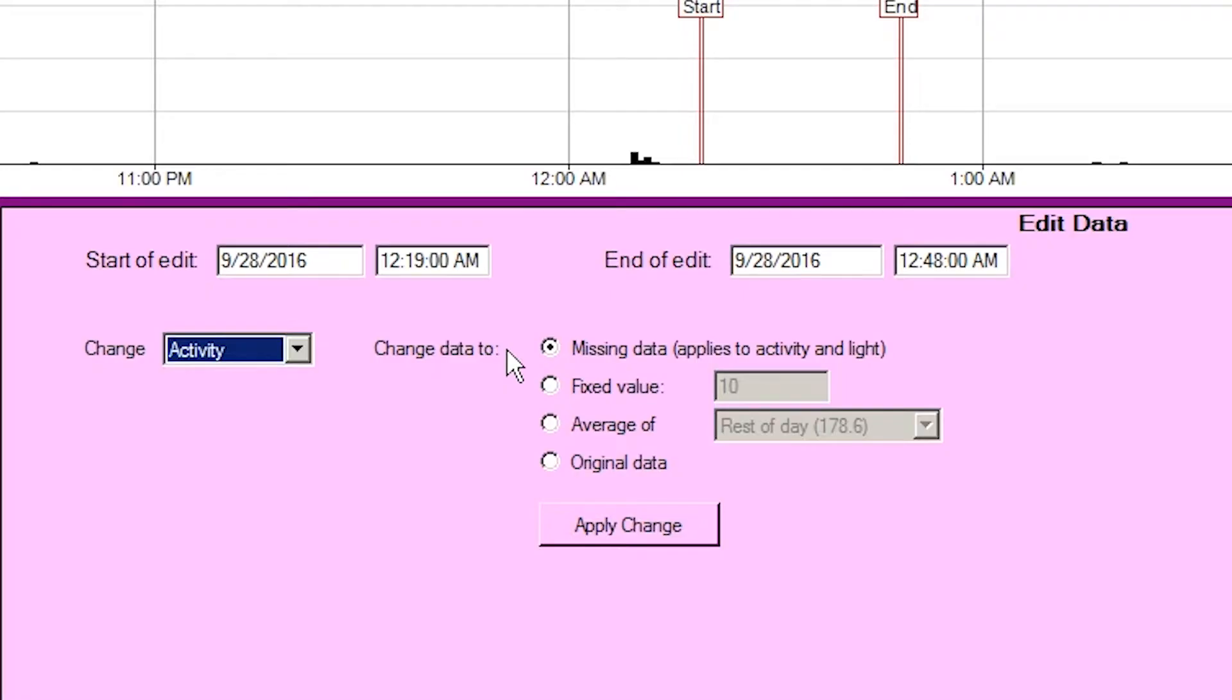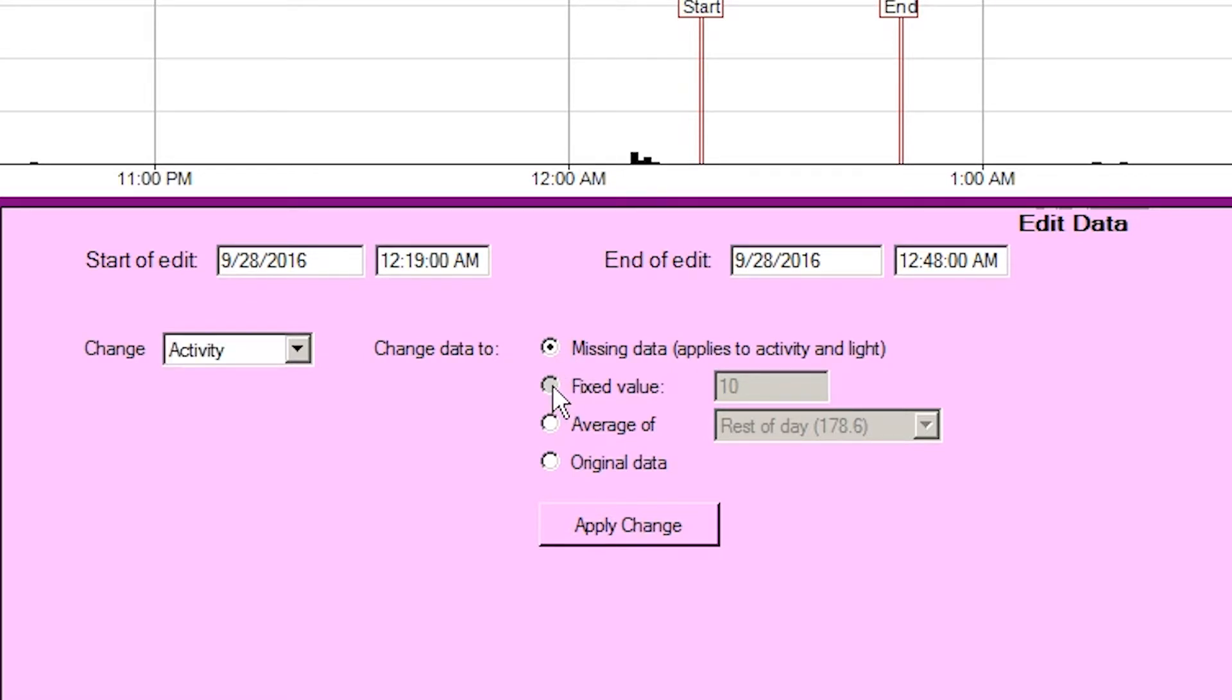The data samples within the selected period can be changed in four different ways. Missing data, this will set the data as missing where the period is shown with a gray background and analysis functions which take an average will ignore the missing samples.